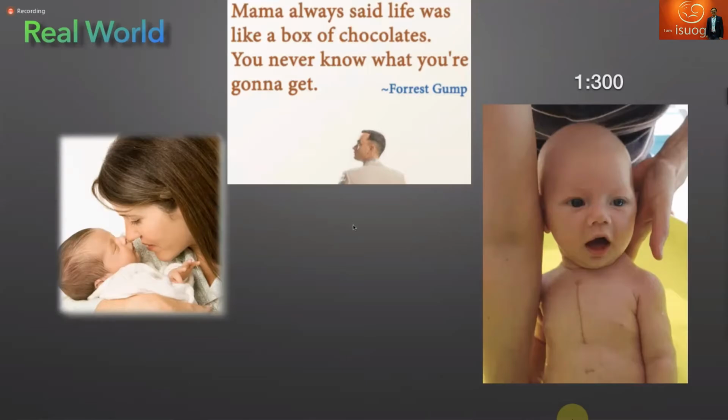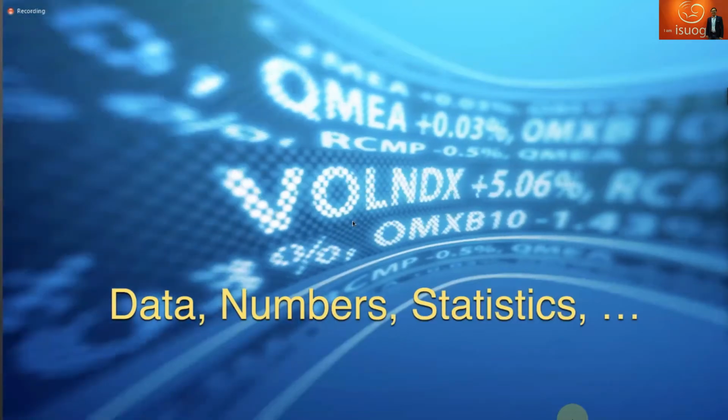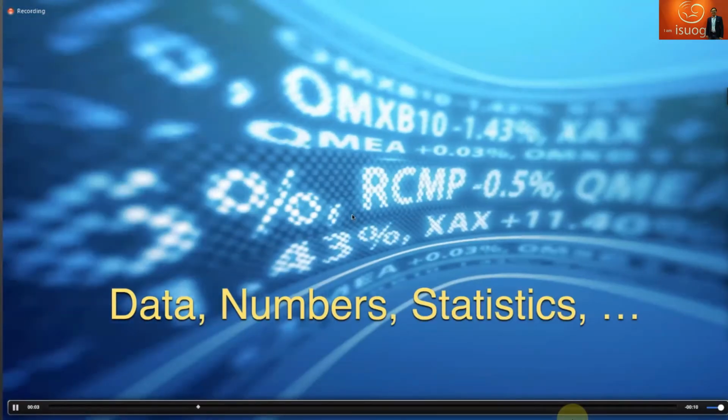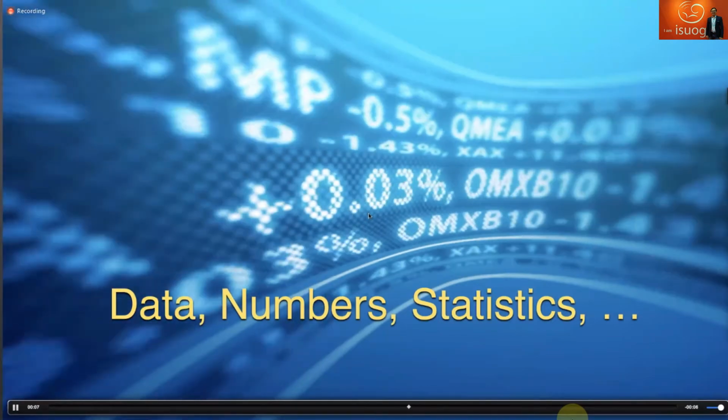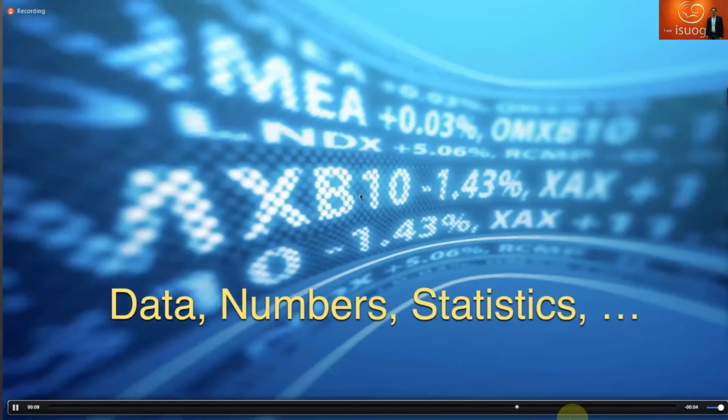So let's start with some numbers. I don't want to bother you with numbers during my talk because personally I will be focusing more on teaching today, but I want us to have some numbers at the end of the day to know what we are speaking about.